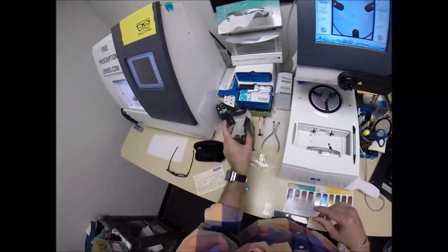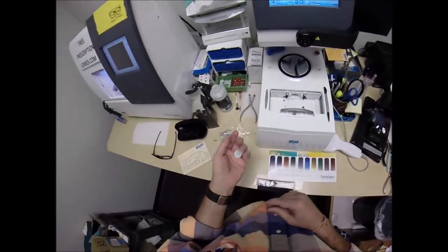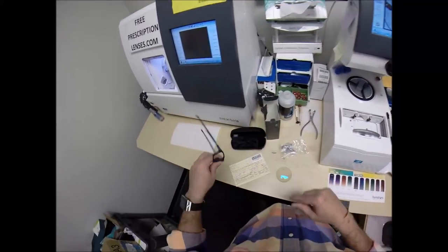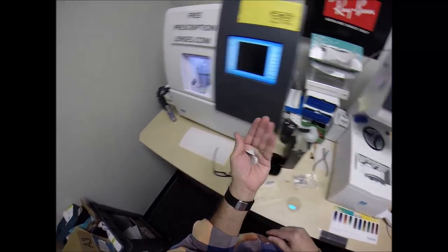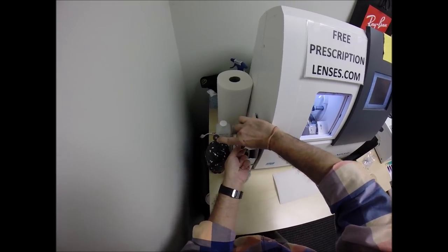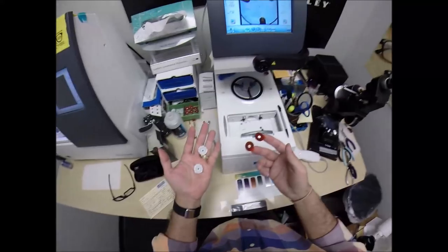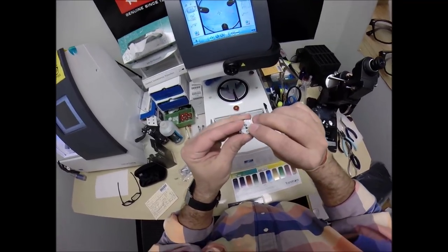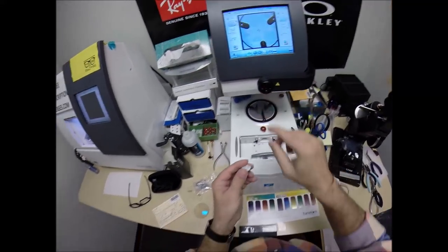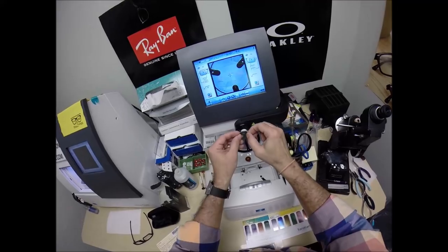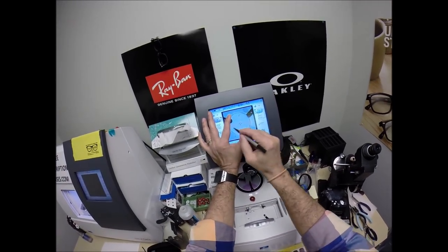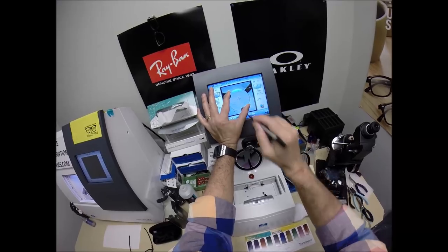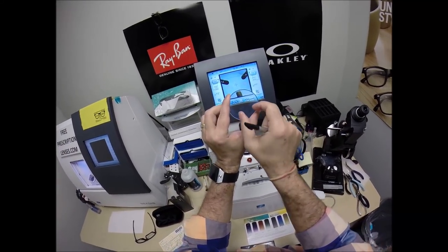I line up those dots over the dots on the layout chart, and that tells me the optical center. I've removed the paint. This is a block, or I like to call it Jenny from the block. I need to attach this to your lens. I'm going to get two double-sided adhesive stickers. On the back is a silver button that is a magnet.